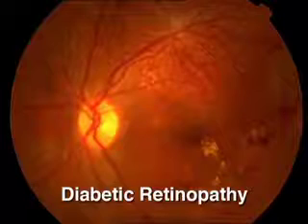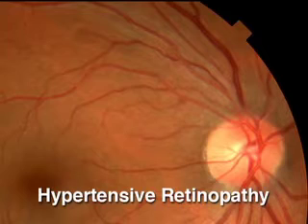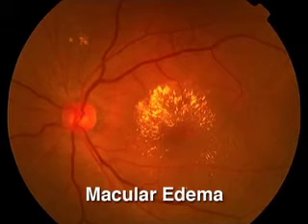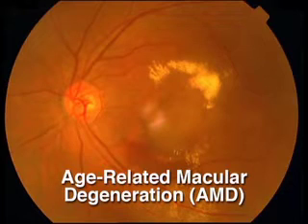diseases. Evaluation of the retina may reveal the initial evidence of diabetic retinopathy, hypertensive retinopathy, macular edema, glaucoma, or age-related macular degeneration. Diagnosis and appropriate interventions can help preserve sight and prevent disease progression.